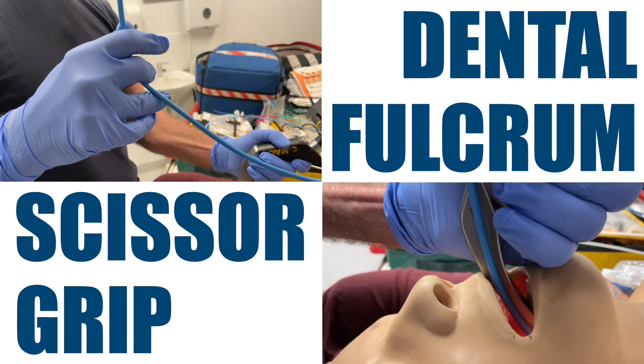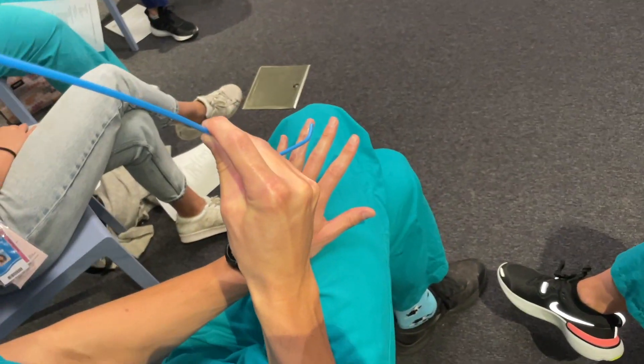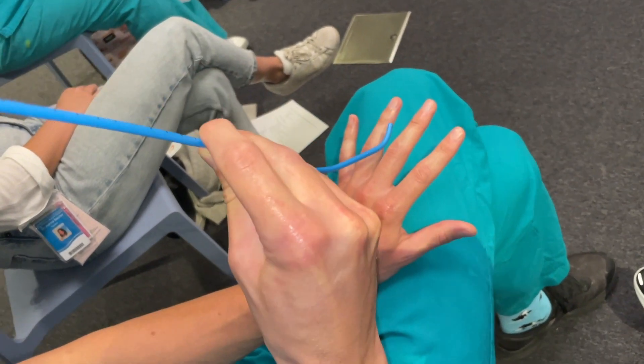These two micro skills come in really handy, and like all micro skills, if you practice them in isolation over and over, they will come naturally to you when you need them.